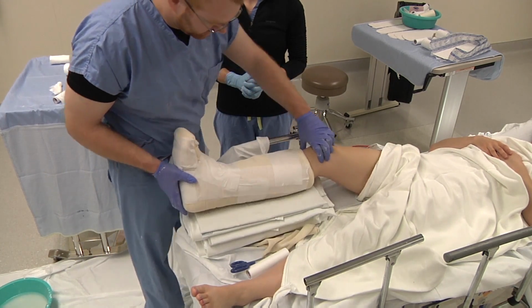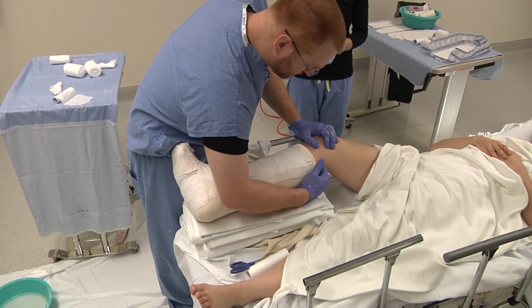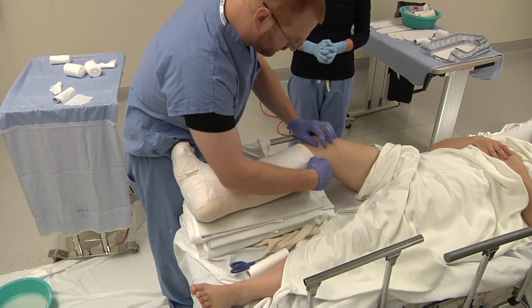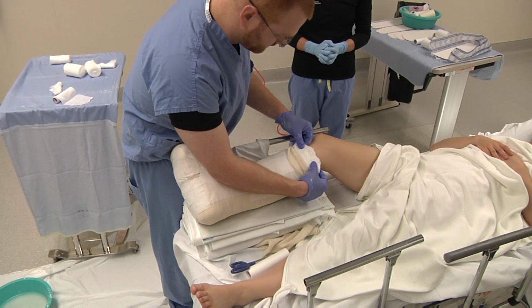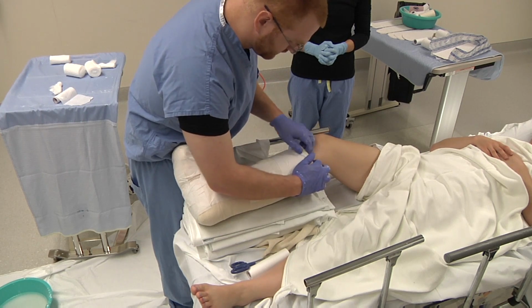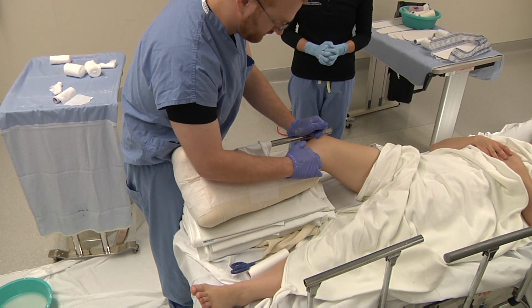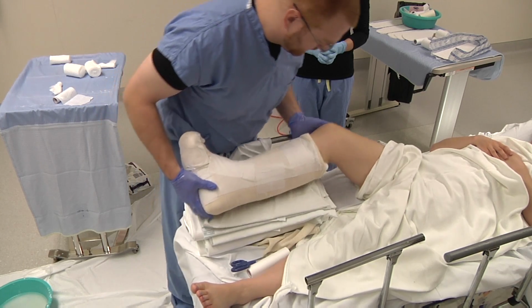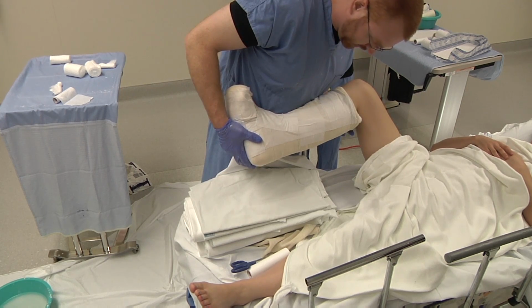Other places that you really need to pay attention, of course, are back here in the popliteal crease. You need to make sure that your plaster is well padded and well covered in this area. You can feel that. A trick to alleviate this is, when your plaster comes up and you have splint material that extends past that, you can actually turn that down, and when you're wrapping your bias over top of that, you can cover that up. Once again, you can tuck that in. Now you have nothing that is sharp or pointy driving into the skin to cause ulcerations. There's also the popliteal crease is free. Even if she bends, the popliteal crease is still free and amply padded there with nothing hard.